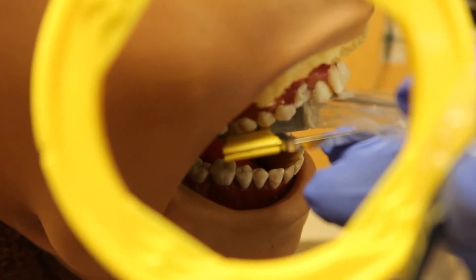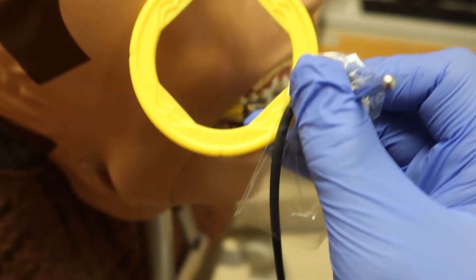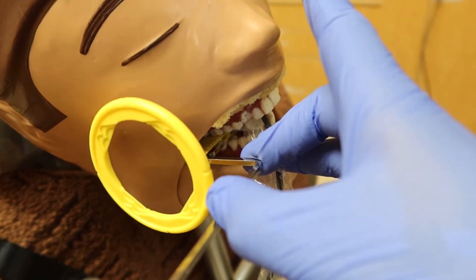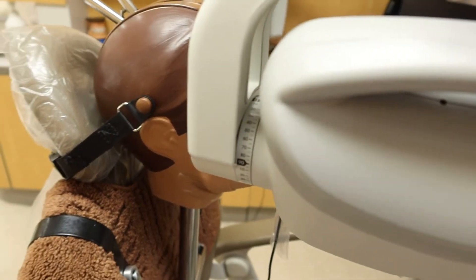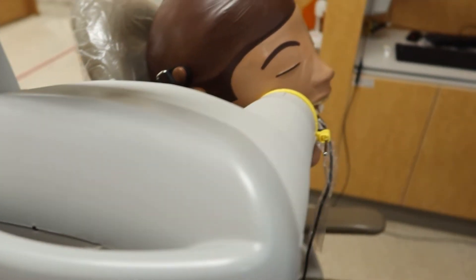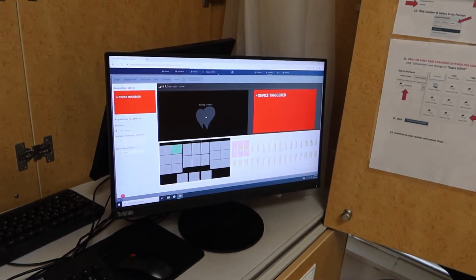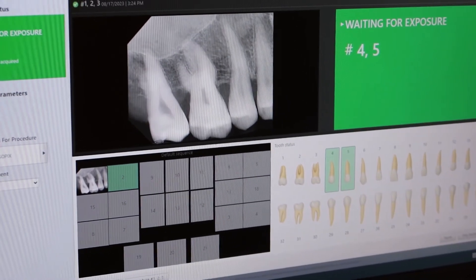As I'm rolling it into place, I hold it against the teeth I want to photograph — right now the molars — and have it sit on the lower molars while held up against the upper teeth, so the patient can bite down nice and tight. The easy part is lining up the tube head: pinch the pole from the back with one finger, thumb it right to the skin. Then take the tube head and make it parallel with the ring — ring to ring, parallel. We take the shot and get a great result: full crown, root tip, and space above to check for abscesses.